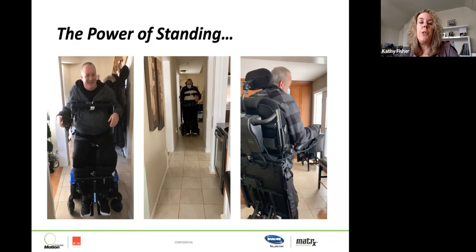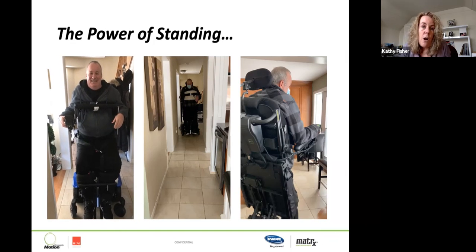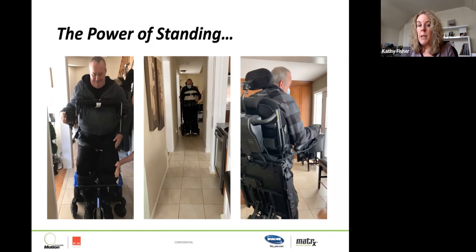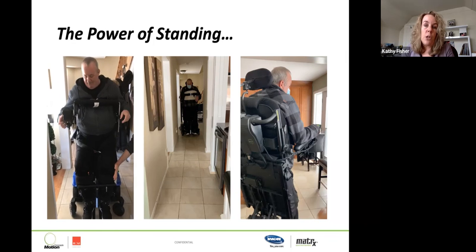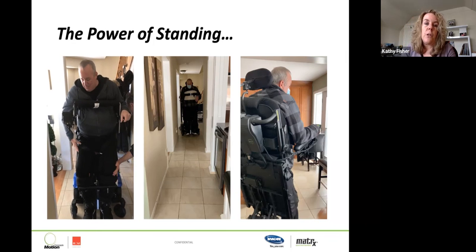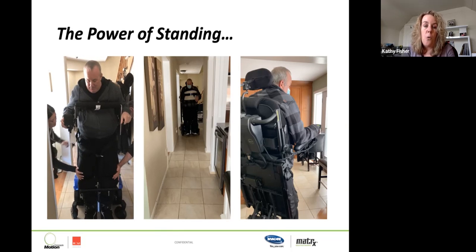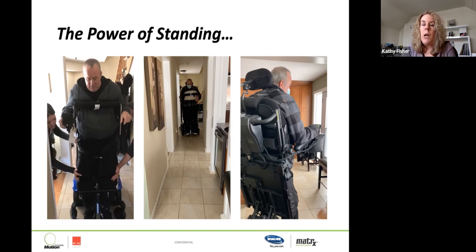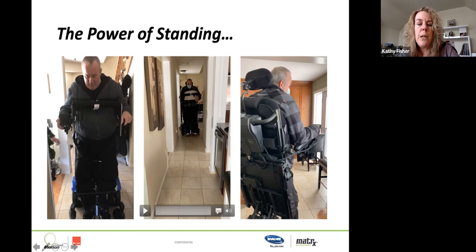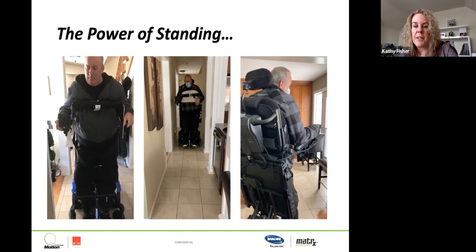Okay, and you'll see we see a number of things happening. We saw his left hip start to drop, and we needed to look at the types of support that he needed to be able to stand. Now, unfortunately, COVID happened. The chair was delivered. I wasn't there for the delivery because, as you can imagine, they were very nervous about having people in their home during the COVID time. So we only just did the follow-up last week. And here he is in the follow-up video. We kind of did the same video.